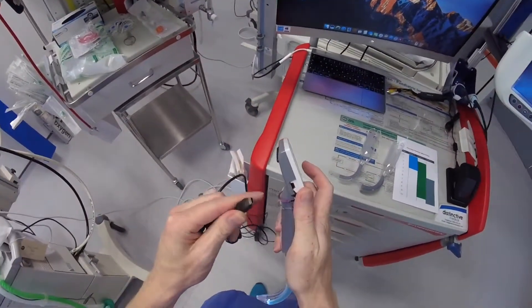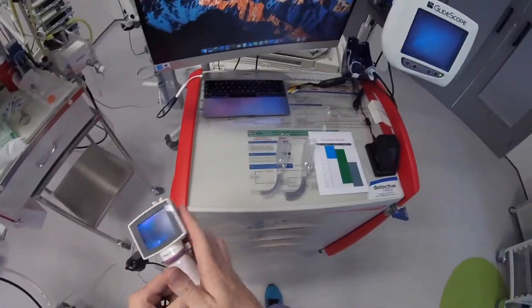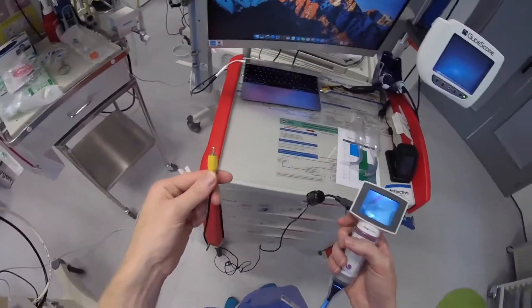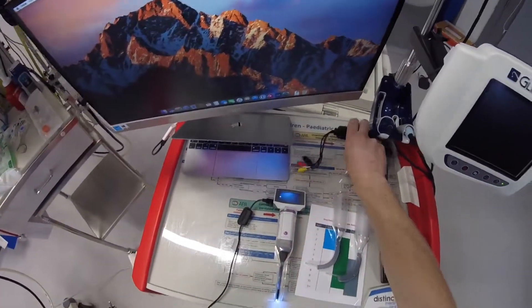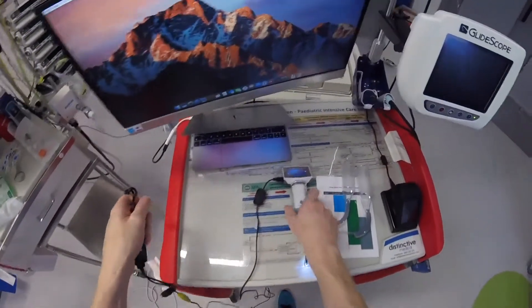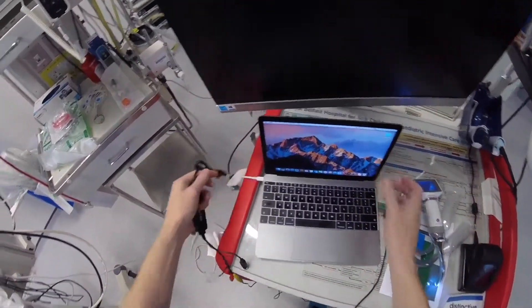The cable just plugs in here. At the end of the cable, you need some way of being able to plug this into your computer or monitor. I found the easiest way was to use a video capture device — this just plugs in here, and then you plug it into the USB port on your computer.